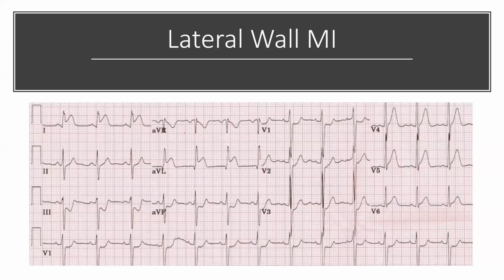So let's take a look at lead 1. Is lead 1 normal, elevated, or depressed? Okay, so it's elevated. How about lead 2? Okay, so normal to depressed.